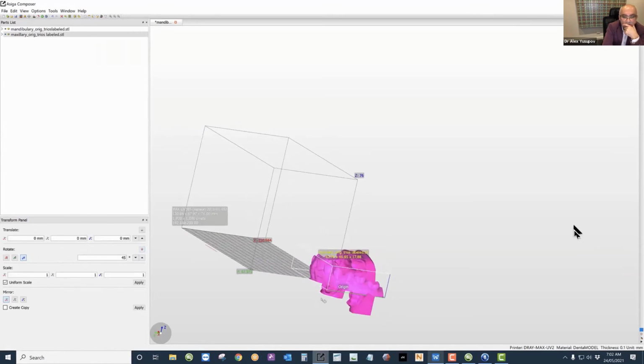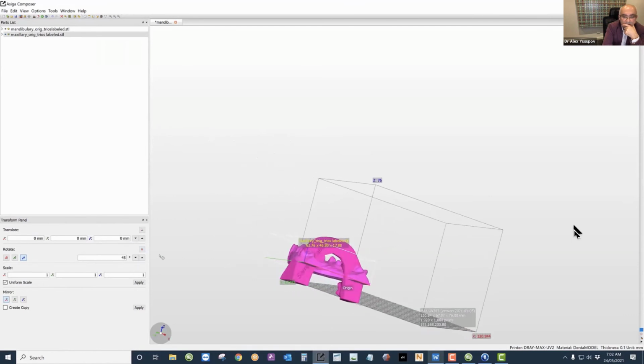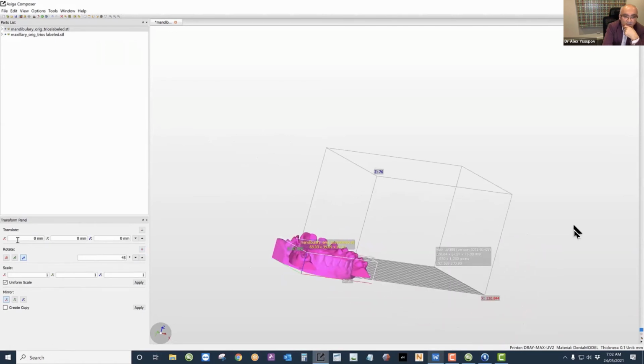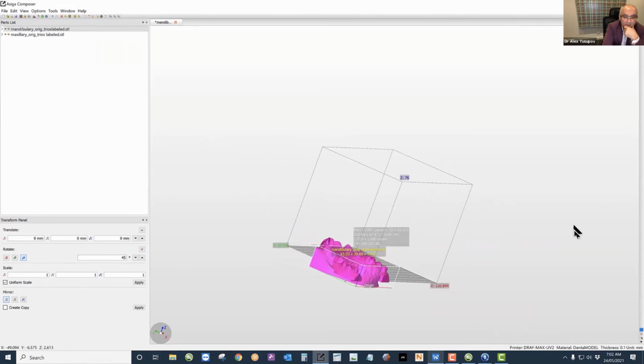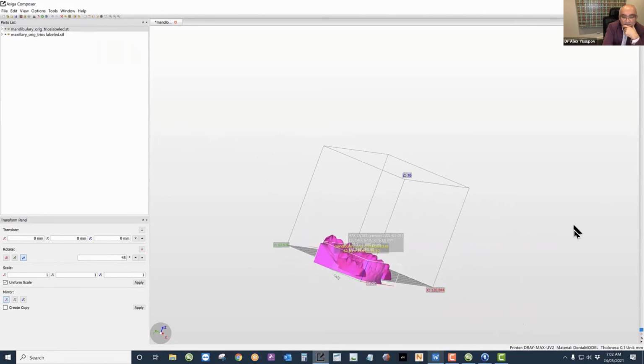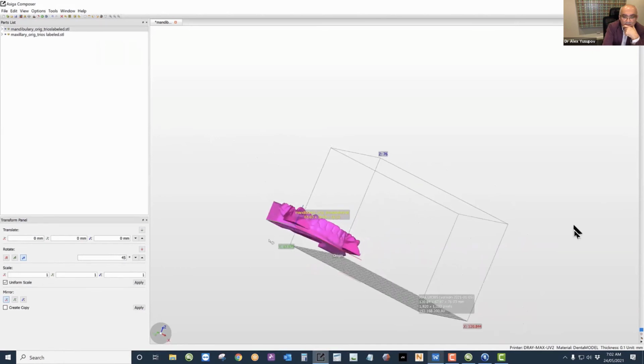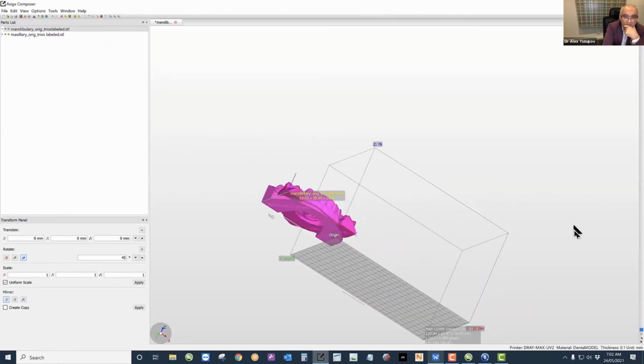So that automatically rotates that model. And the next thing we do is we do the same to the other model and rotate the facet down. Now, the reason why I don't use angulation changes is because the model might not necessarily be at right angles or vertical when it comes in. So it's always safer just to nominate which surface you want to be flat.